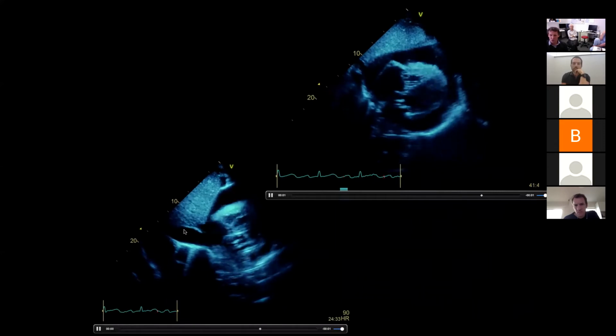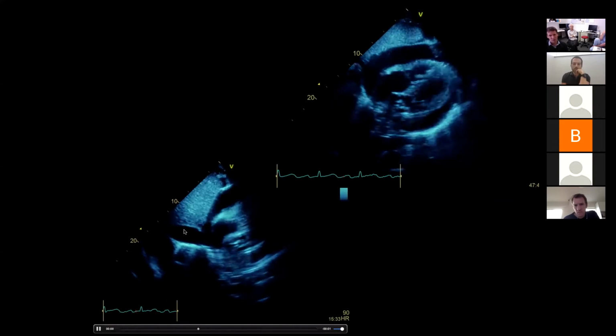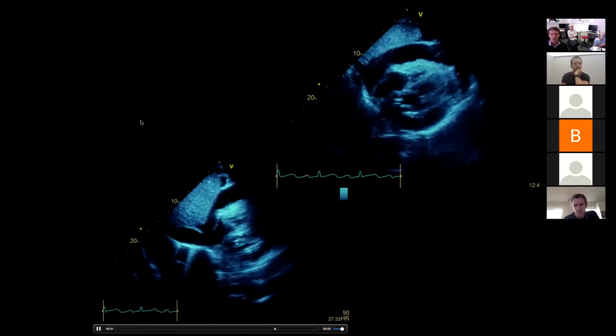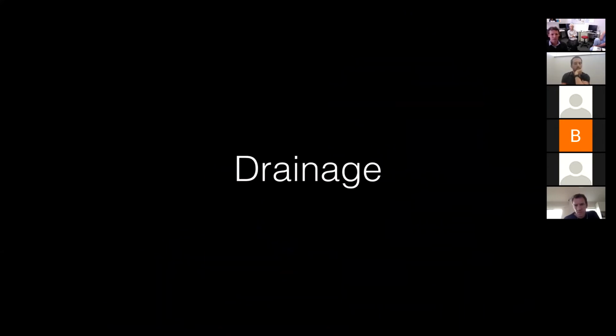And are we dealing with pseudo-tamponade though? Can we give us some fluid and buy us some time? Well, no. I think we've got a big dilated IVC here. And I'm sorry, we don't have the Doppler.